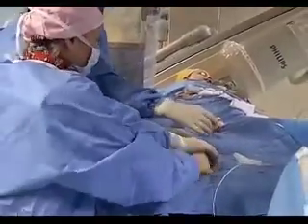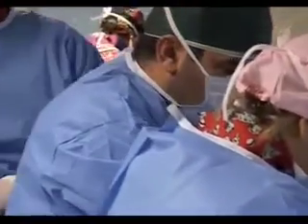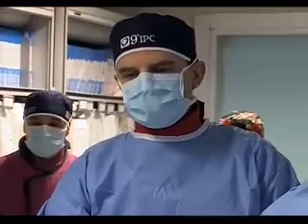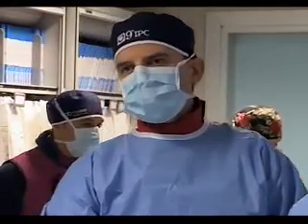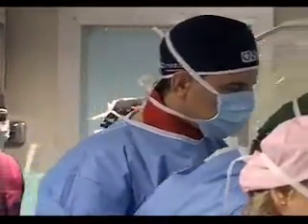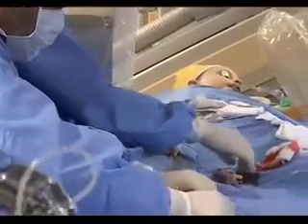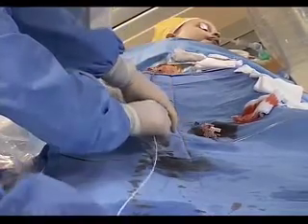So Massimo, you have a 9 French sheath in, is that correct? Yeah, 9 French sheath, yes. Actually, the stent can also fit into an 8 French sheath, but in some cases we had some difficulties pulling out the balloon once inflated. So I prefer to use the 9 French sheath. The suggestion is 8 or 9 French sheath. Yeah, that also allows you to do your angiogram and precise placement if you don't have a second arterial catheter. Yes, exactly.